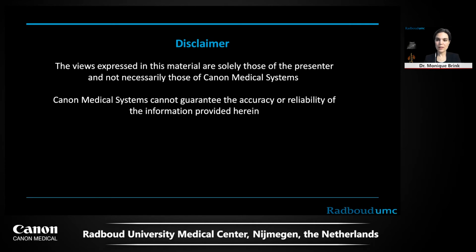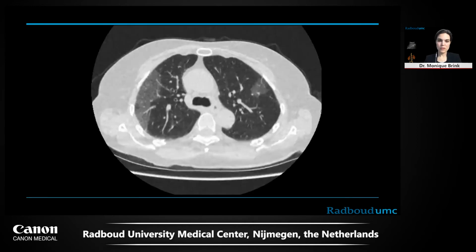After that, I'm going to show you a representative slide of a CT scan of a 77-year-old female who presented to our emergency ward with typical dyspnea and fever, but a negative PCR for SARS-CoV-2. And I will show this slide here. You can see this patient has some features which actually are typical for COVID-19.